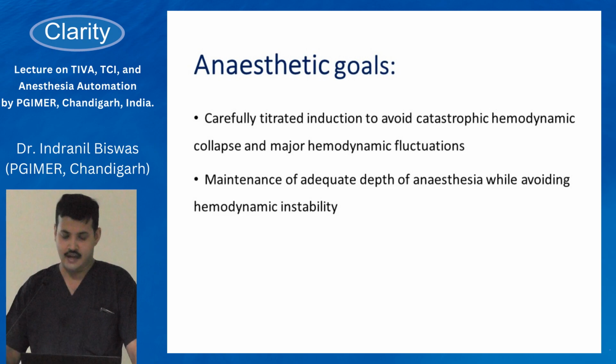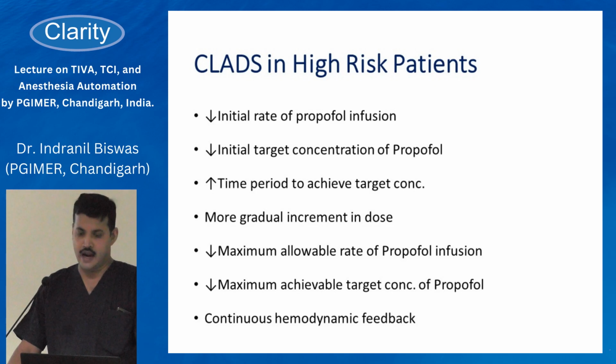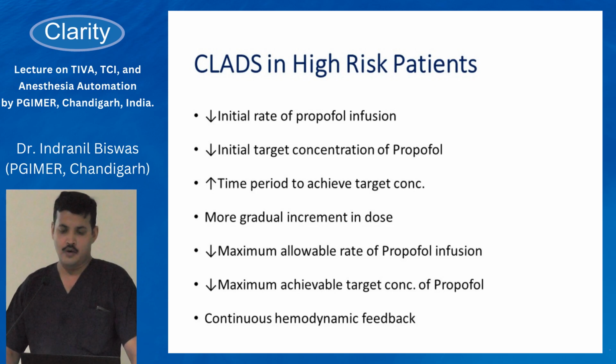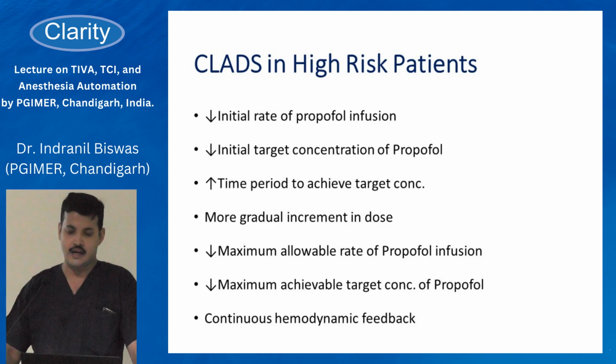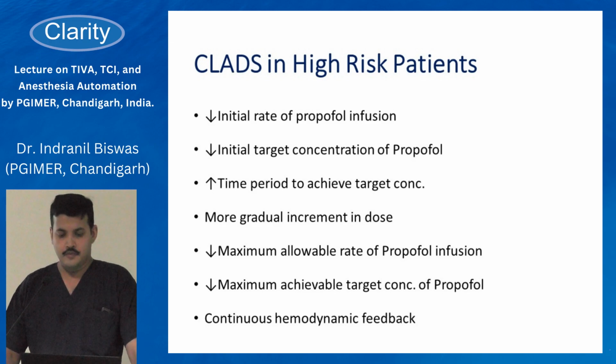Now, how does CLADS address all of these? We have a high risk and very high risk mode in CLADS. Whenever we choose that option, it reduces the initial rate of propofol infusion, compared with the rate at which CLADS starts the infusion in normal patients.